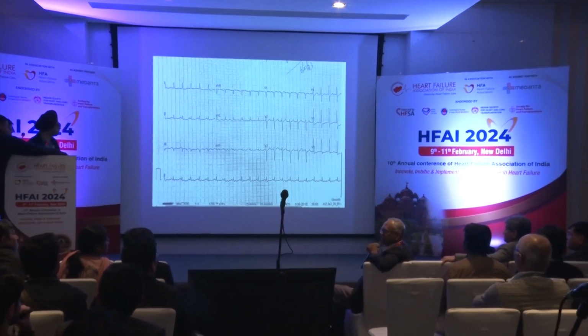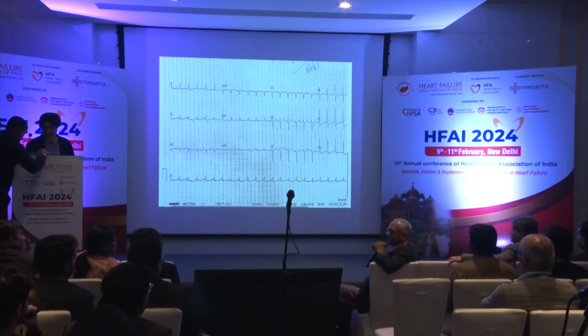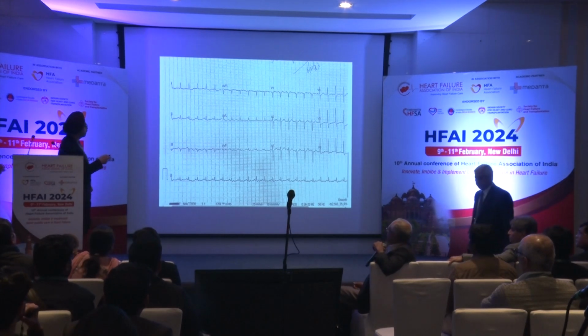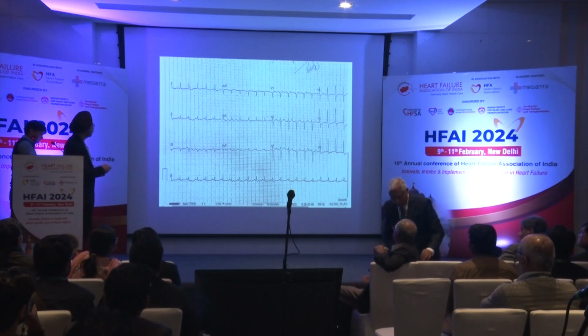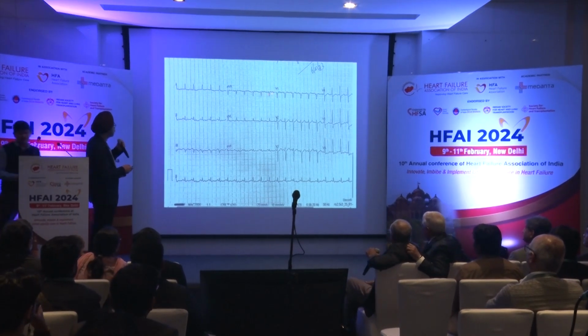They may not be very symptomatic. The classic symptom is the moment he walks, he climbs up stairs, he'll become very symptomatic. Why? So now if you see, you try to first understand, can a sinus tachycardia have 2:1 block?